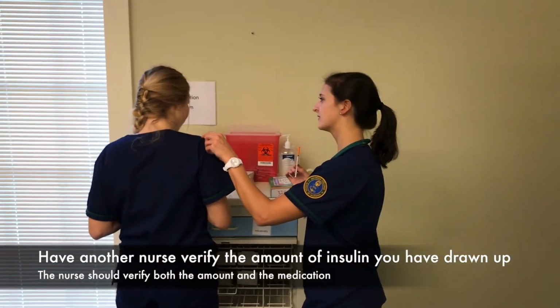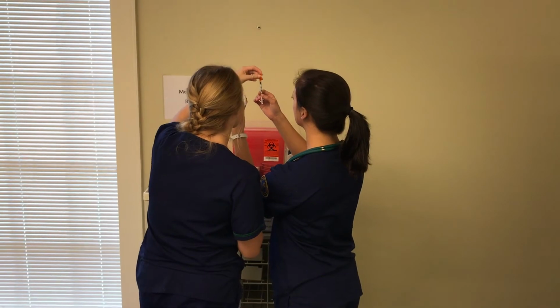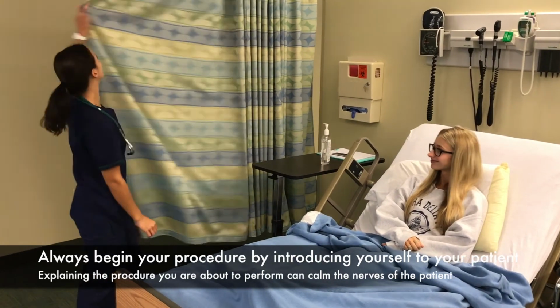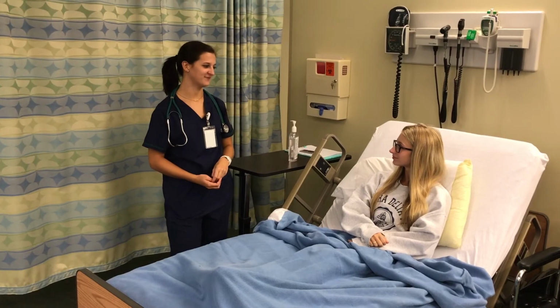For insulin administration, you have to have another nurse verify the type of insulin and the amount of insulin for your patient. Hi, I'm Hannah, and I'm going to be your nurse today. I'm going to be giving you a subcutaneous injection of insulin.